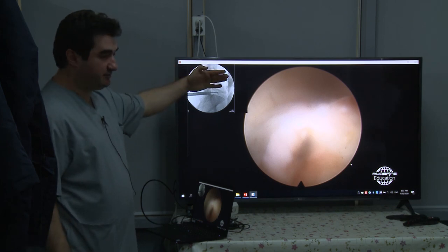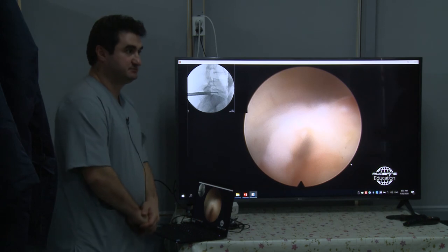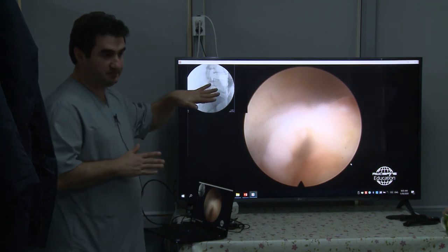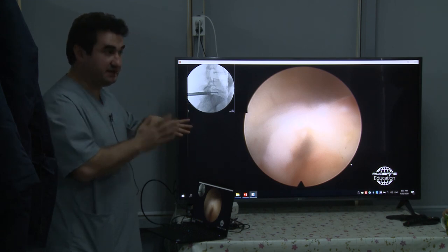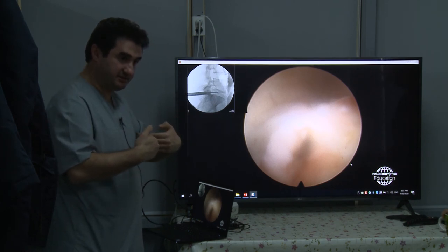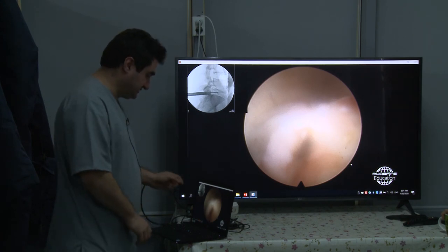But we don't go to the flavum, we just go to the bone and dissect the adhesions between the bone and the adhesions and then go inside the spinal canal like this. So, like the previous approach, you do the same? No, it's like that. There is no flavum after the open surgery, because usually they cut it. Then we find the bone first, not the flavum. We find the bone, and then we dissect the adhesions between the bone and the scar tissue, and we go there. Like open surgery, what you do there, yeah, we find it. But I do not have it with me.